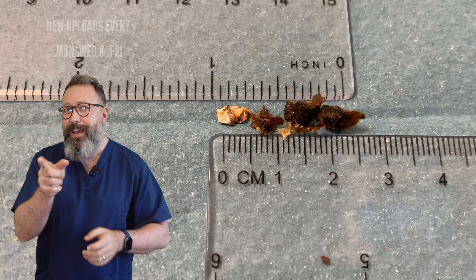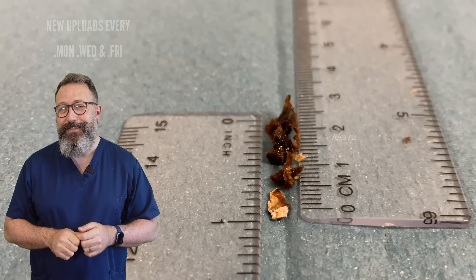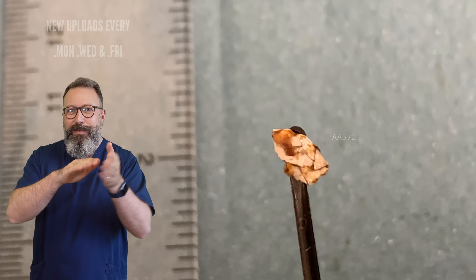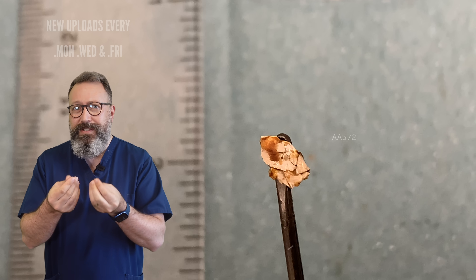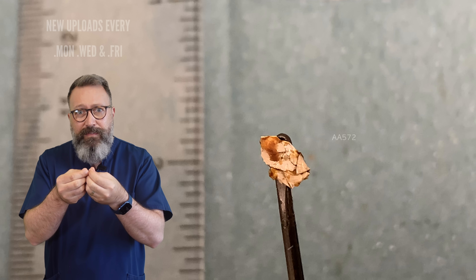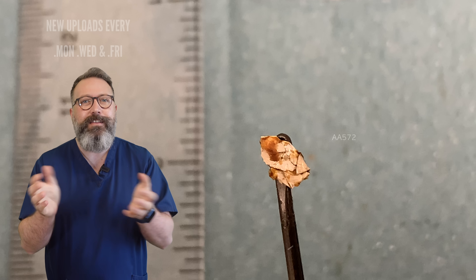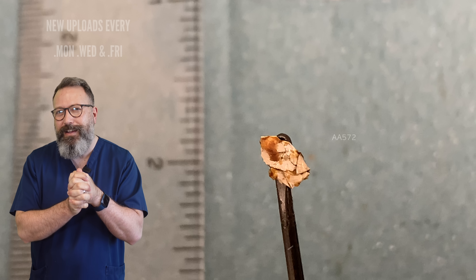So this is what we removed. That foreign body is to the right-hand side — it was embedded in one of the larger pieces of wax. Can you see it there glinting? That was actually a piece of metal. When you look at it, you can almost see it's been folded over. It was absolutely solid — I first thought it was a piece of tin foil because it looks like foil that's been folded over, but it was so solid, there was no give to it. It's a real angular and sharp piece of metal that the patient had in their ear. No idea how that got in there — the only thing I could think of is they wear in-ear headphones and a piece had broken off, but I'm not too sure about that. It looks the wrong kind of shape for that.